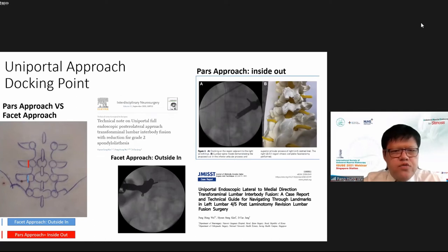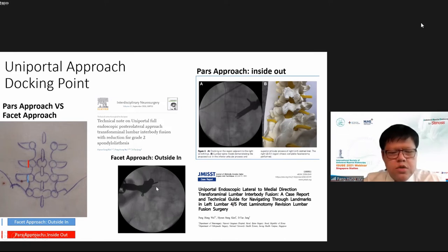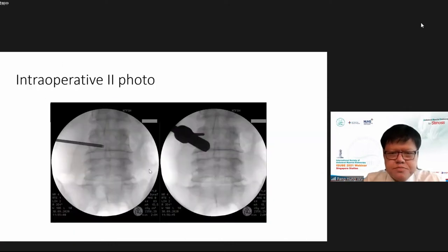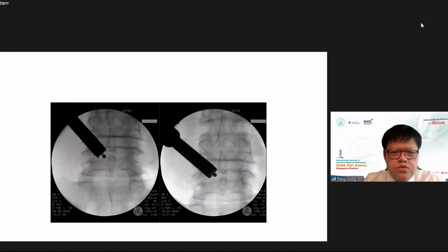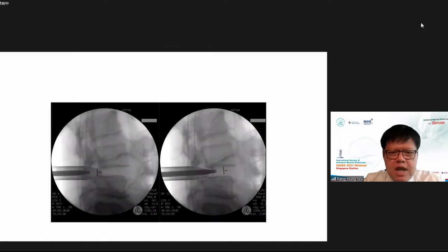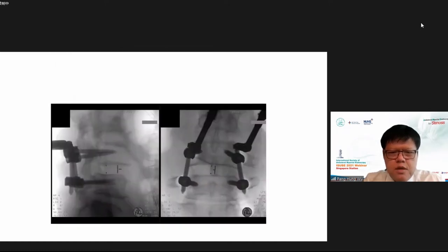For uniportal posterior lateral T-LIF, we use the stenosis scope docked at the isthmus area. We drill across the isthmus and harvest the inferior articular process using the uniportal working retractor tube. This is a case performed last year — we drilled across the isthmus, harvested the facet, retracted the traversing nerve root, and placed the cage. The final result is one year out with no screw loosening and confirmed spinal fusion.